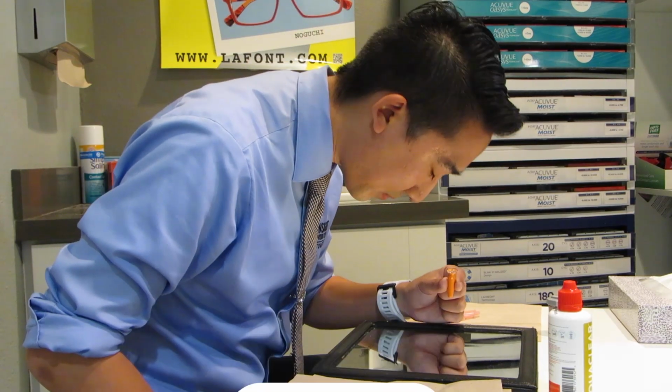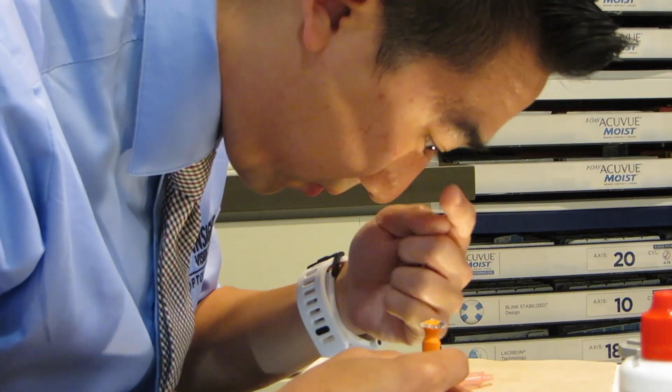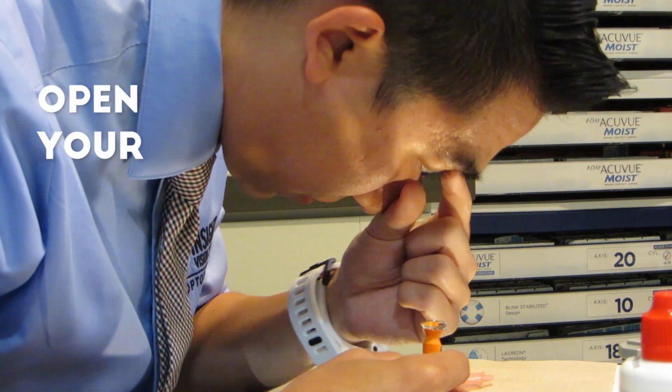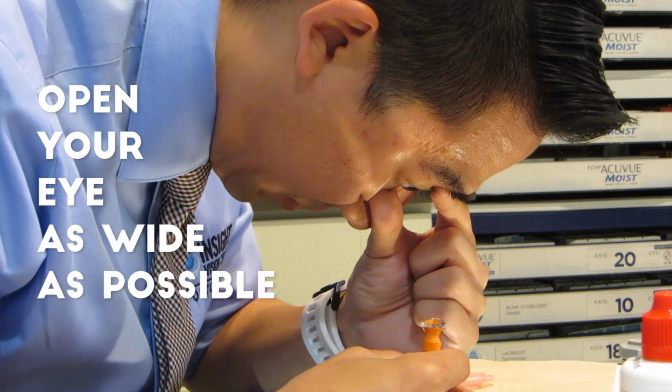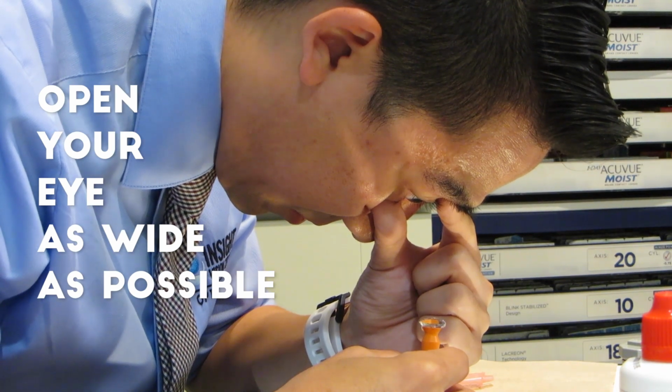Step 6. Bring your chin all the way down so that your face is parallel to the table. Step 7. Use your non-dominant hand to open your eye as wide as possible. Really stretch your upper and lower eyelid open so your lashes don't get in the way.